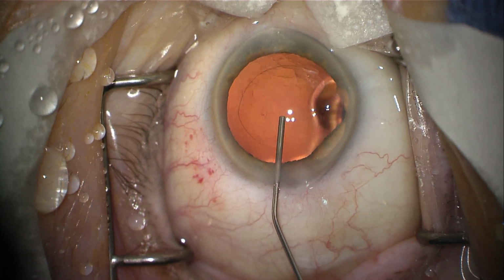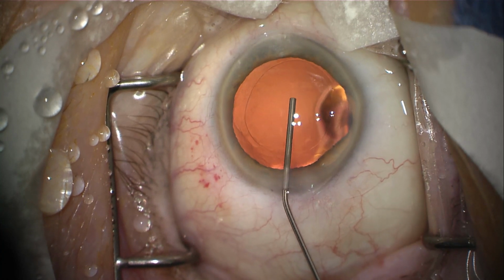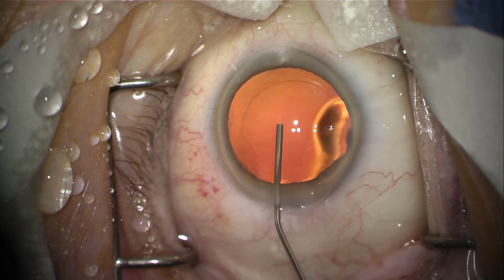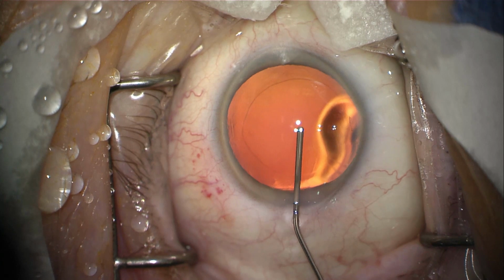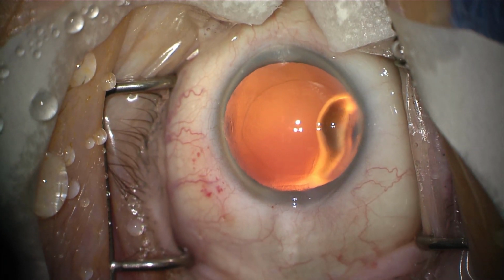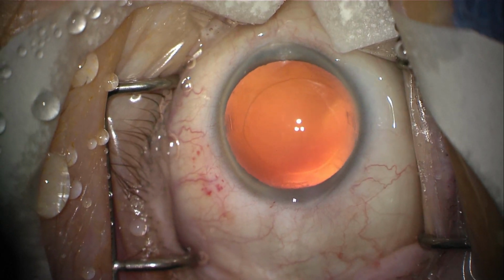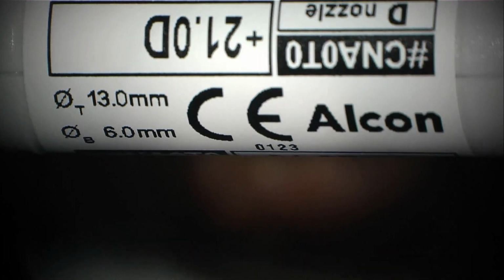And I'm also going to inflate the capsule, the M&M candy shell, with this thick gel. Because the gel is very thick, it stays inside the eye and it basically gives me space to work in. Keep in mind, everything is about 3 or 4 millimeters apart. Next thing is I'm going to put a lens implant inside the eye. My current favored lens implant is made by Alcon.